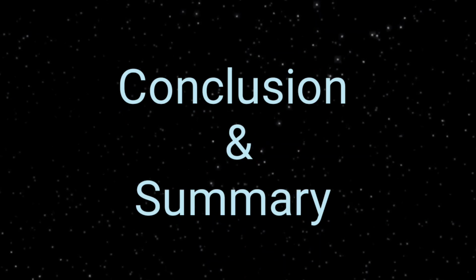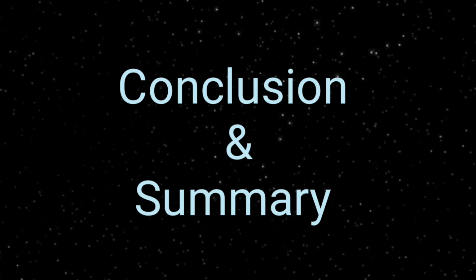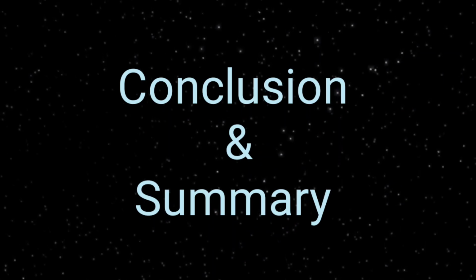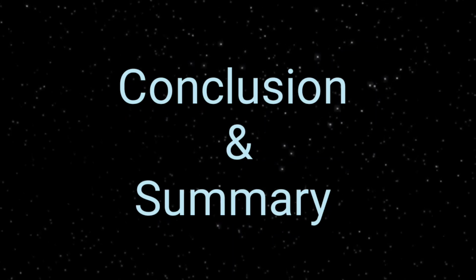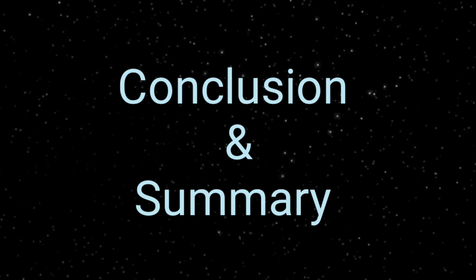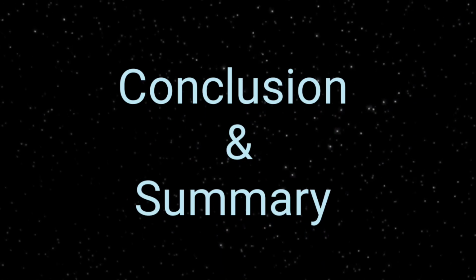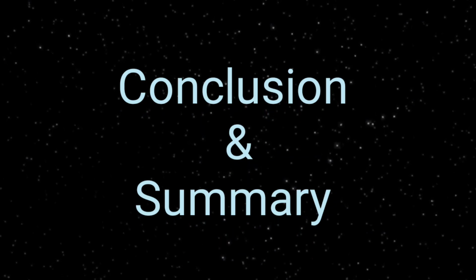I do hope this would be a very useful video for you, and this would be a first layer of knowledge to understand the 4 grades of the WHO regarding astrocytoma. It's not very difficult, quite easy. Always keep the age of the patient and the location of the lesion in mind. This will help you towards a correct diagnosis.